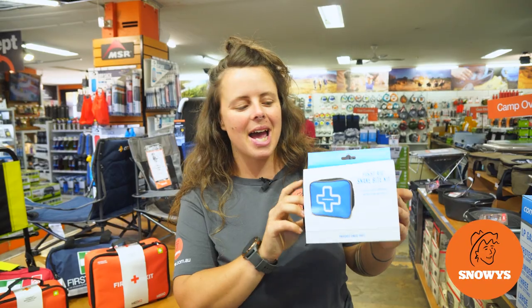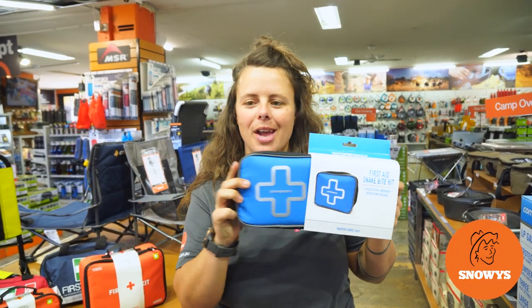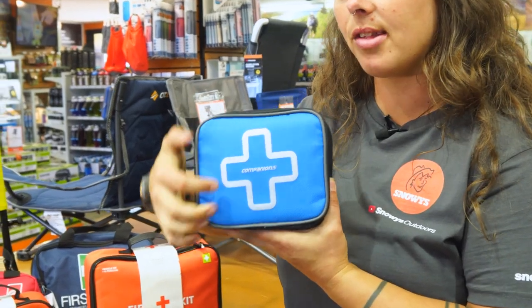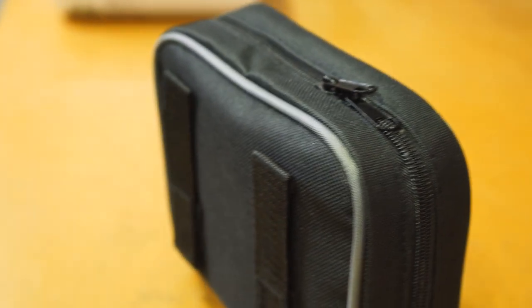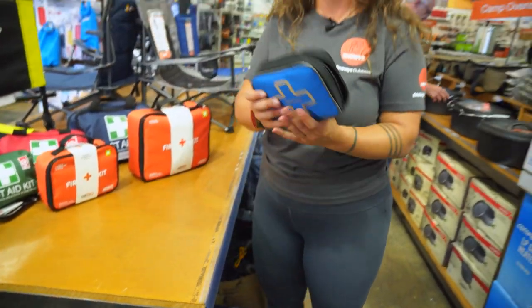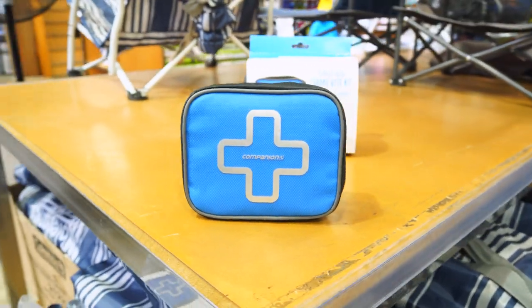Hey folks, Lauren from Snowys here. I have with me the Companion First Aid Snake Bite Kit. Super compact and light, it has these nifty little belt loop straps on it. You can attach it to your bag or on your hip pocket for easy access for treating snake and spider bites.